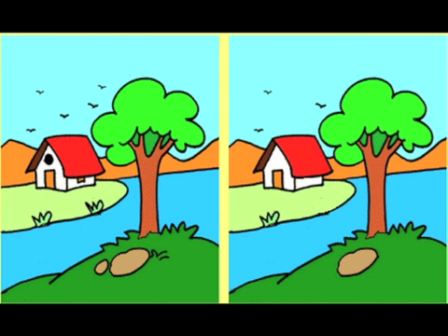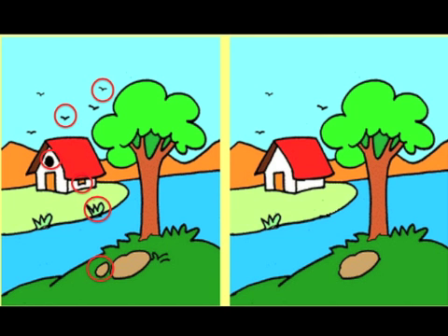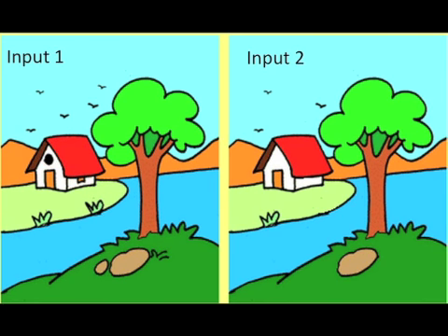One way to think about differential amplifiers is to think of the common game that is seen on children's menus at fast food restaurants everywhere. There are two pictures, and the child is asked to notice the difference between these two pictures. For those of you playing along at home, I have outlined the 6 differences between the two pictures using red circles. Let's extend the metaphor and call the first picture input 1 while the second picture is input 2.